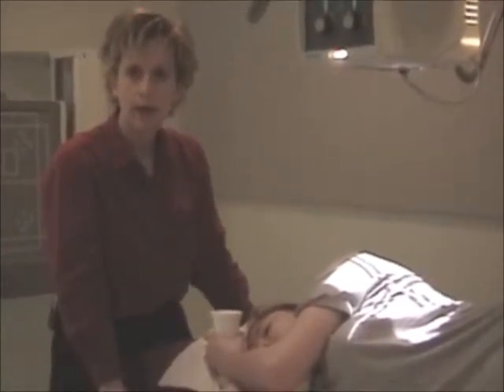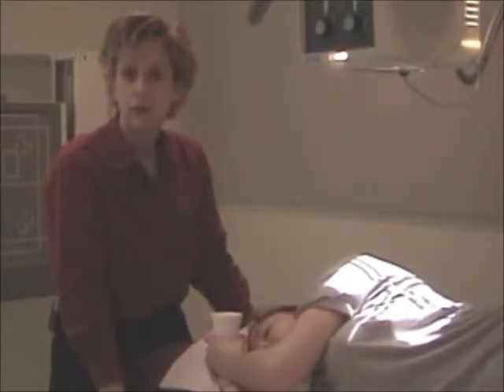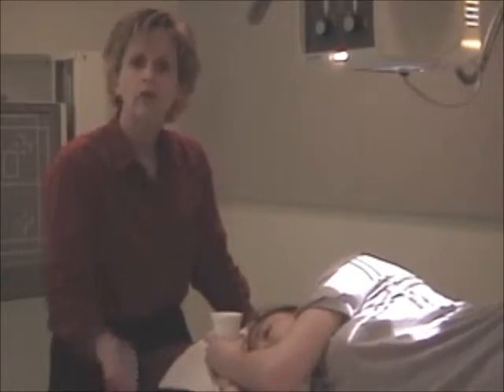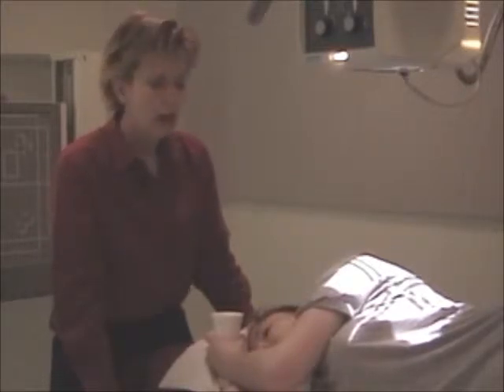Let them know that it's important for them to take big swallows, since it is difficult to catch barium in the esophageal tract. Have them take about 4 swallows and make your exposure if you can see the epiglottis go up, or you just hope luck is with you if you can't see it go up. You might do other obliques, but if you remember the film's edge is level with the mouth and the esophagus is anterior to the spine, you'd be able to do any position that a physician would ask you to do for an esophagus.